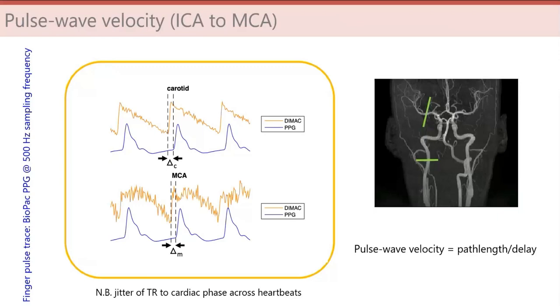But an important point to note here is that with, for example, 4D flow phase contrast measures, we can also measure the pulse waveform. However, that has to be averaged over many heartbeats. It takes several minutes to acquire, so we're looking at hundreds of heartbeats. When we look at these key timing dynamics, by averaging over these heartbeats you blur out the response. The key bit here is the leading edge, the onset of the pulse. And sometimes, especially with 4D flow, where you trigger based on the peak, not on the onset, I feel we can be blurring out that leading edge a bit.